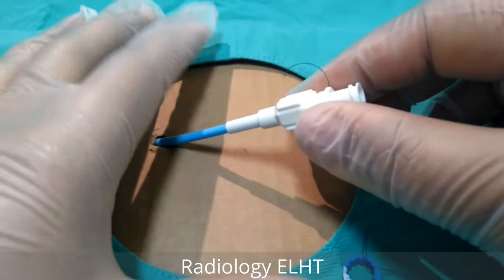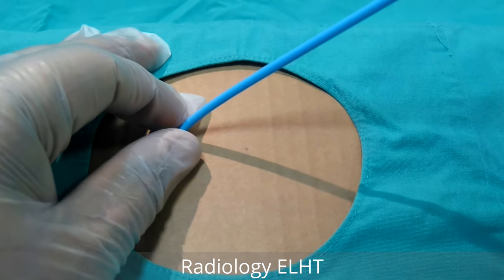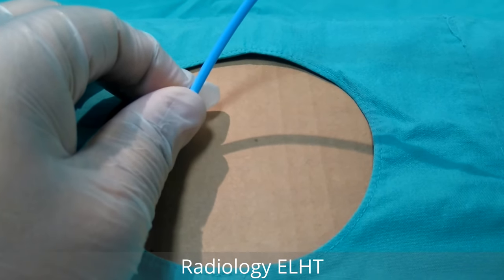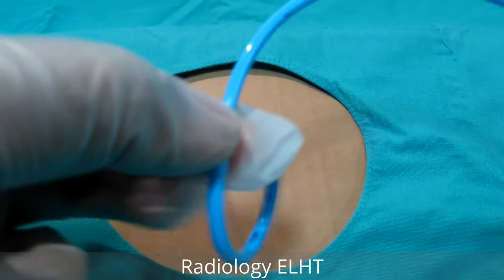Pull back, and gently pull the drain out. You may get some resistance as it comes towards the skin, and the pigtail will come out.